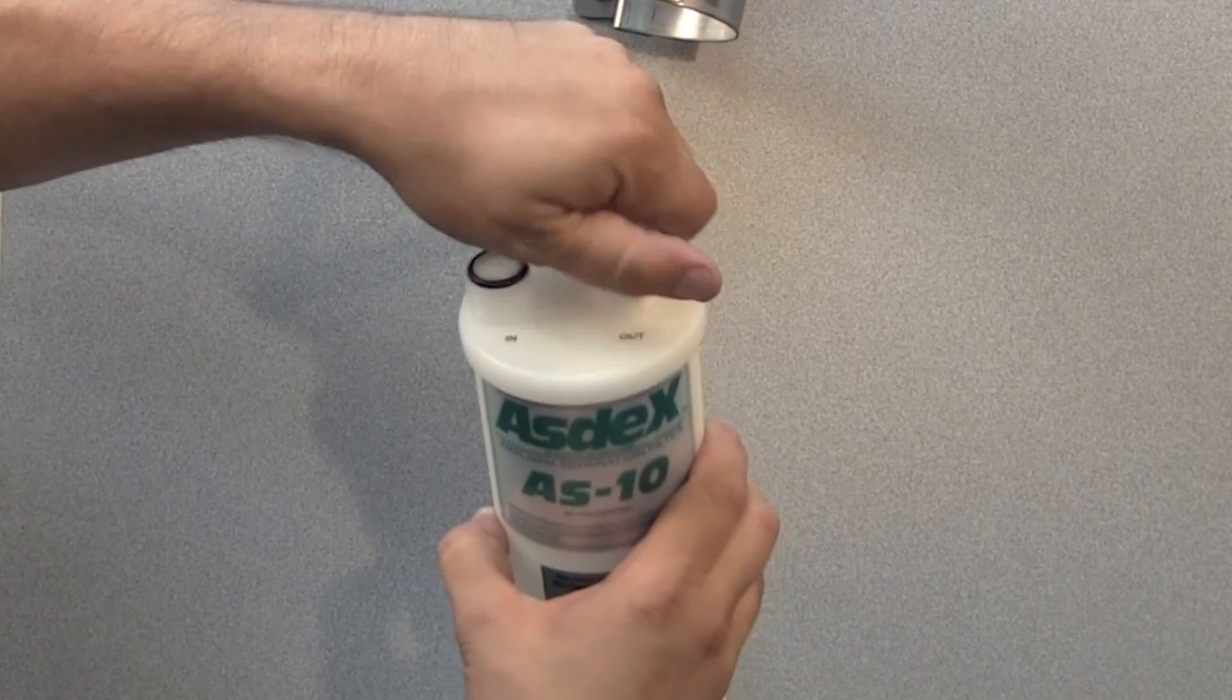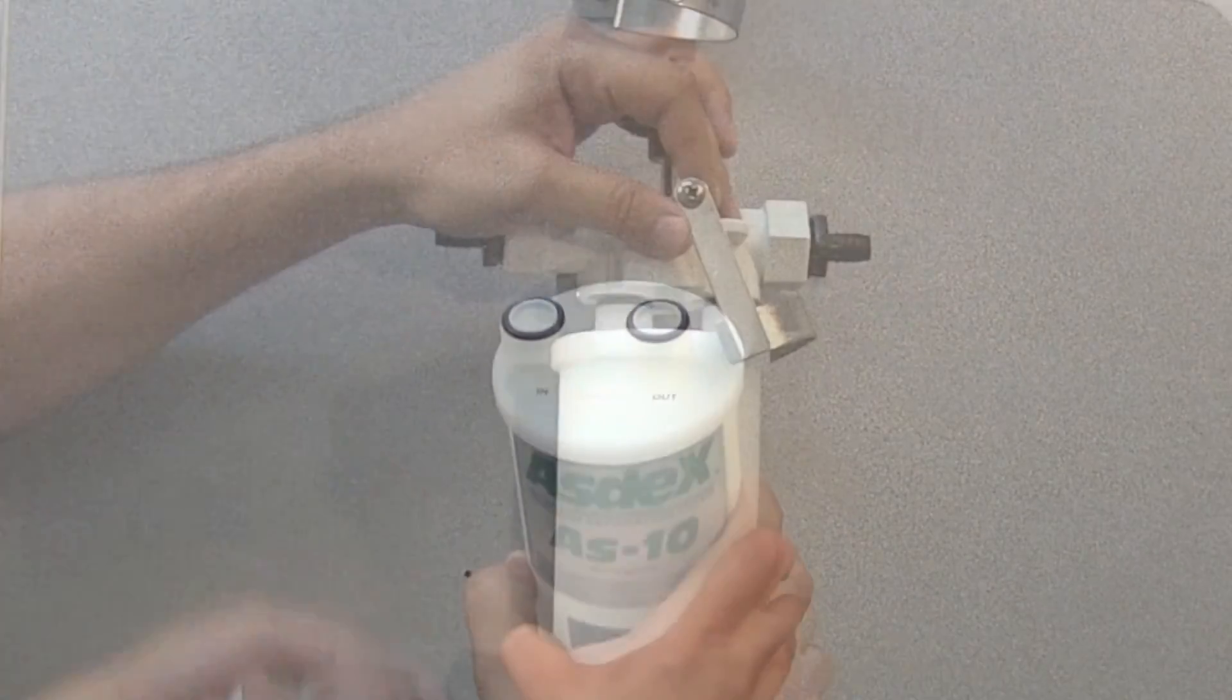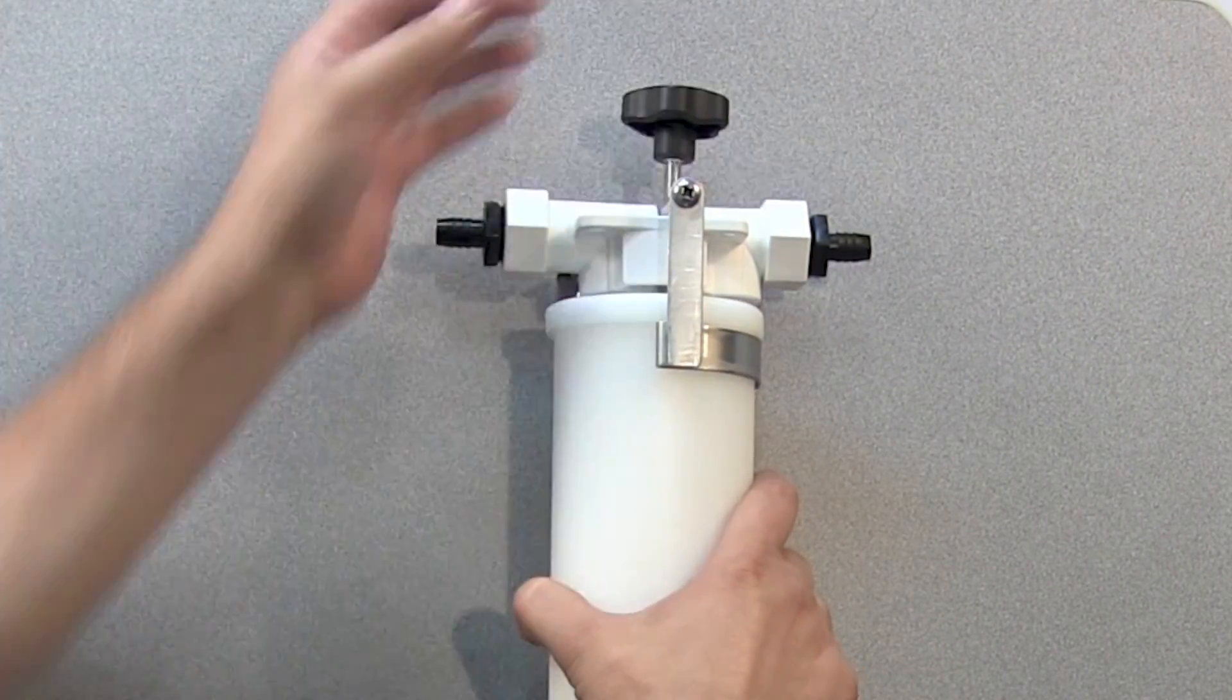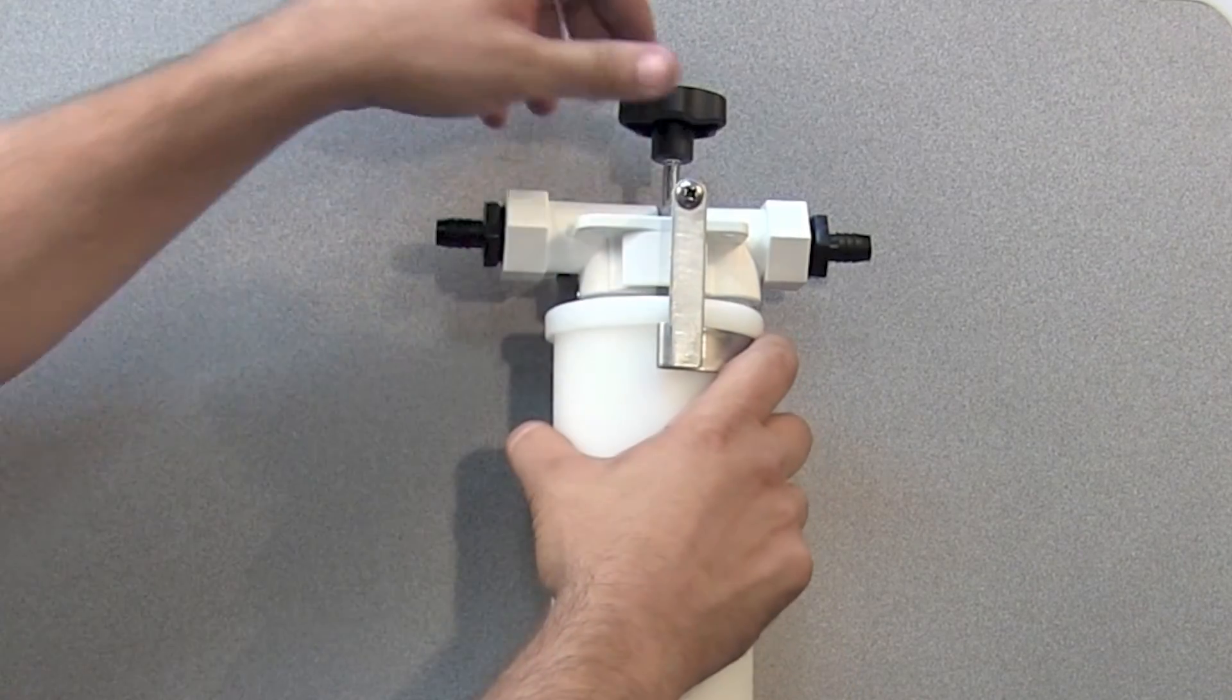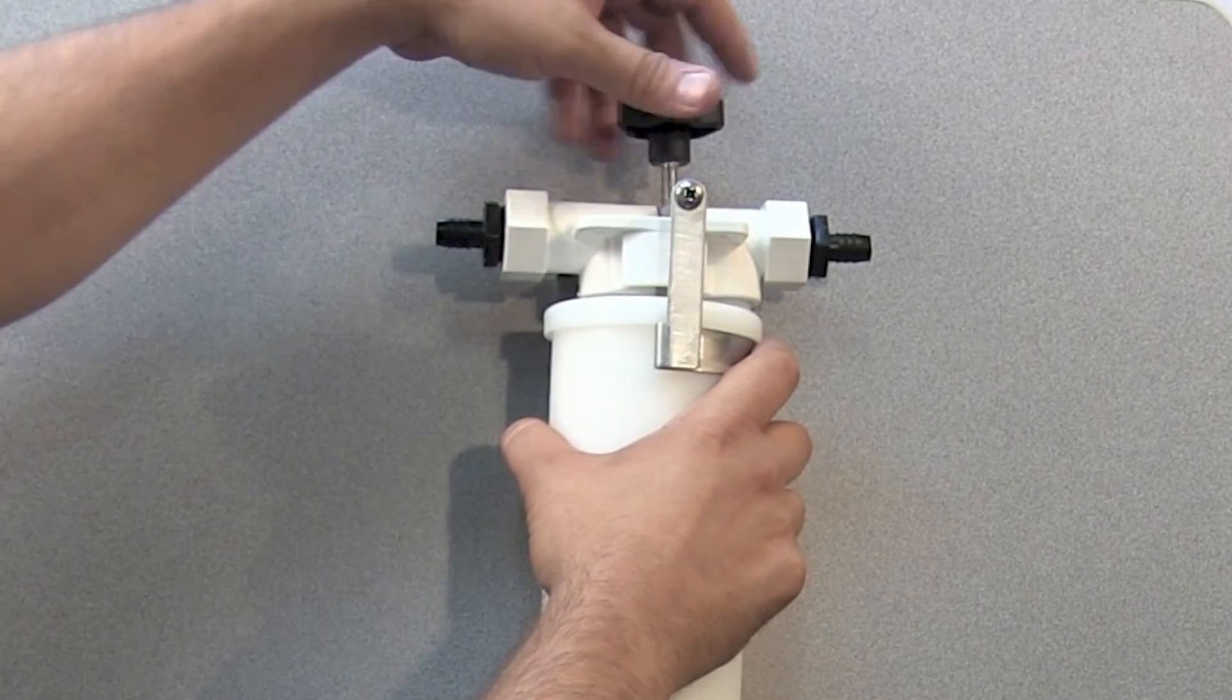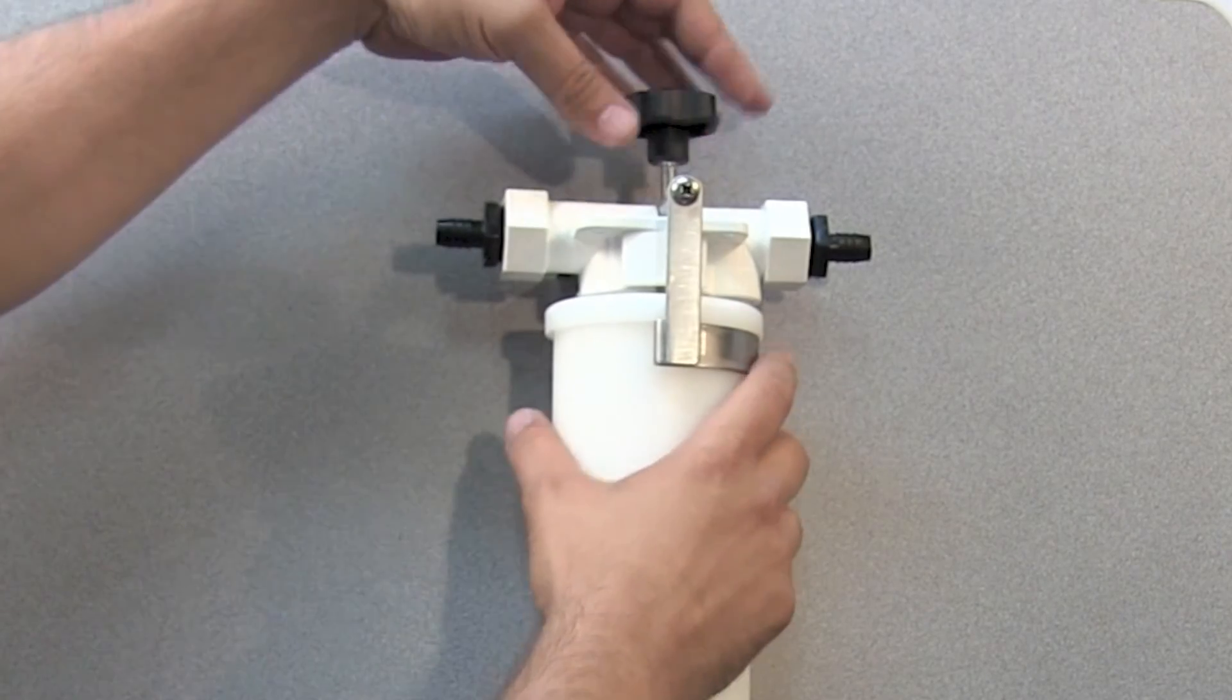Align up the inlet and outlet ports on the collection separation filter to the inlet and outlet ports on the manifold and push the filter into place. Turn the retaining knob clockwise to seat the filter snugly.